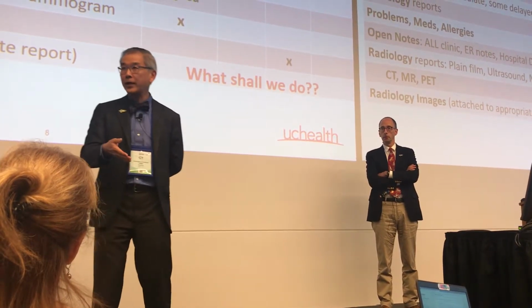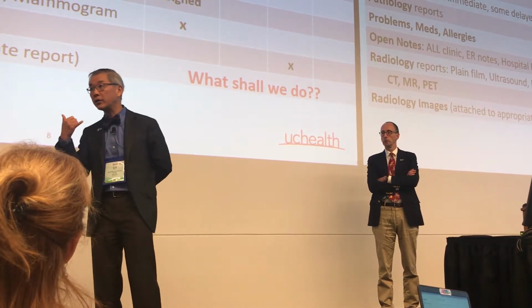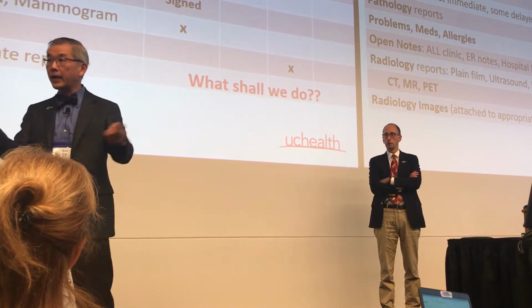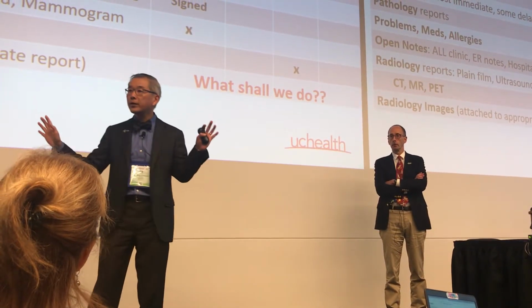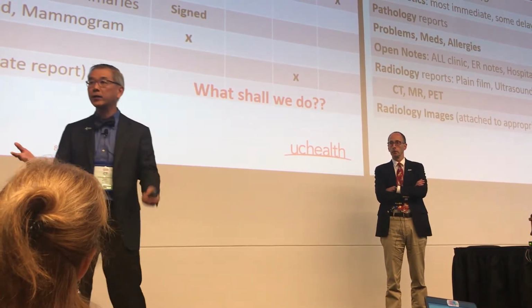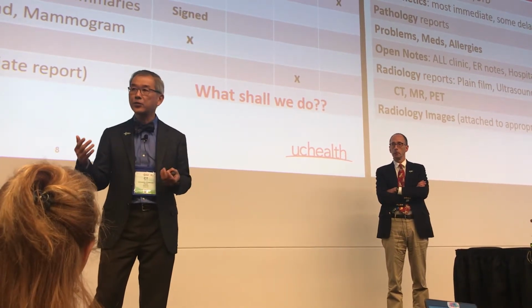Oncologist leaves Friday afternoon for an out-of-town meeting. Saturday, patient sees the image, calls up the on-call doctor. What is going on? How did you hack into our system? A lot of unhappiness, and it was a big kerfuffle, with the oncology center saying, turn the whole darn thing off. This is a terrible idea. See what you did to this patient. And that's not a good outcome. We then put them on the 7-day delay that everyone else is on, and it's been a non-issue since then.